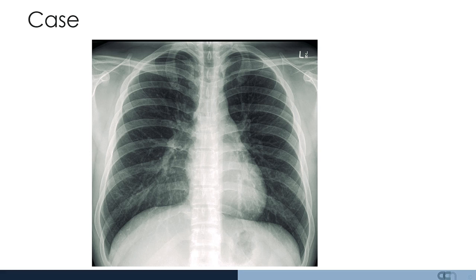Let's start by having a look at this normal chest radiograph. Start by determining the view. This is a standard posteroanterior view where the patient is standing approximately six feet from the beam and the source is coming from the back of the patient through to the front.